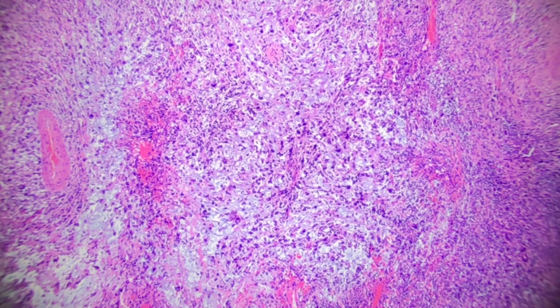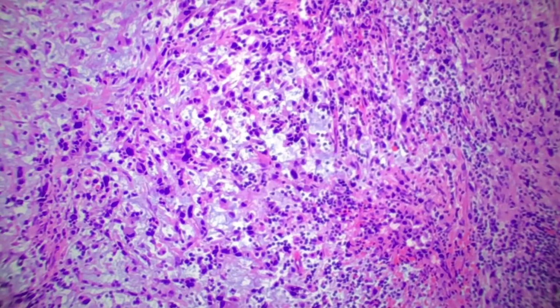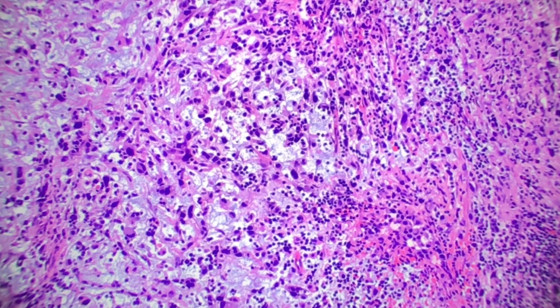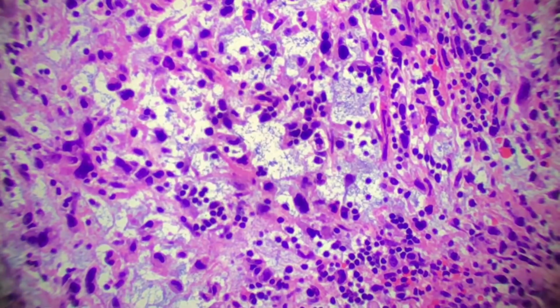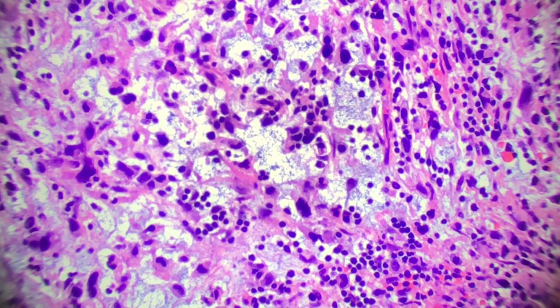So if you see on, let's get a little more of a contrast. On the right side of the field, we have the very dense blue tumor area, and then on the left side, we have more of a gray-blue, loose, almost myxoid change, this desmoplastic change. So I think it's a little easier to appreciate now at 10x. If I go to 20, again, focus. Okay, so from here you can see how we have more of that looser stroma, but it is still that gray-blue that we think of for desmoplastic response.